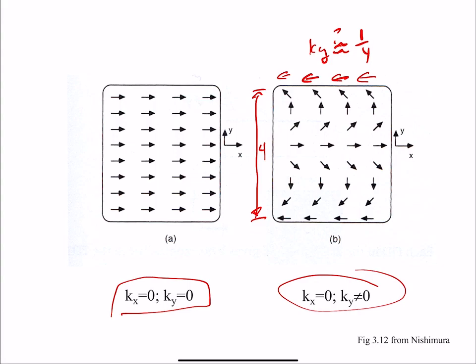Okay, question. Is this in the frequency domain, or are we talking about this in spatial domain? That's a good question. So this is in the spatial domain. When we think about the spins, we're always thinking about space. That's actually physical space. That's actually what's going on in your body. So you can imagine all these spins in your body and they're aligned in a certain way, okay?